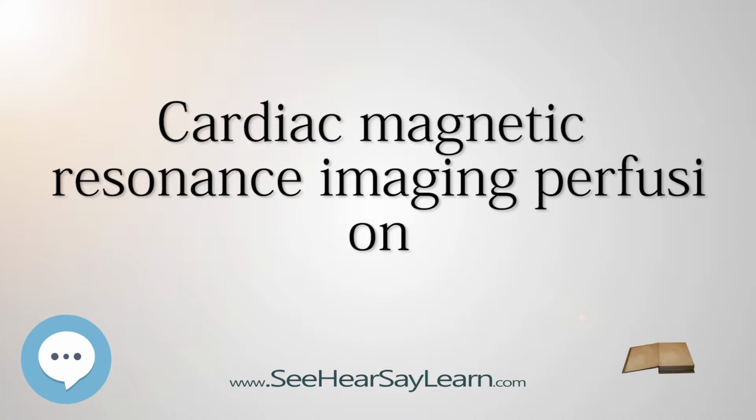bypass surgery. To screen patients who have chest pain and risk factors for coronary artery disease, to assess for ischemia which may be caused by a narrowing in one of the coronary arteries. This could then, if it shows ischemia, be further investigated with another imaging modality to directly image the coronary arteries such as invasive coronary angiography.